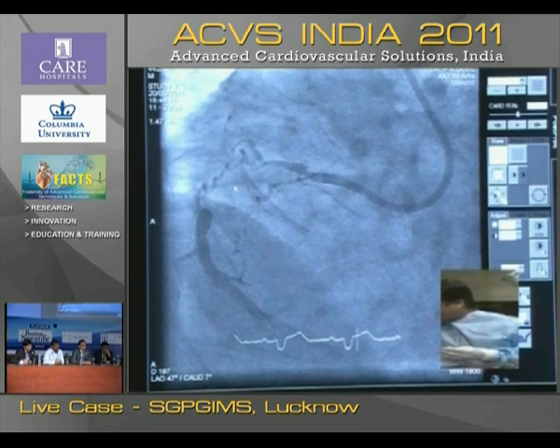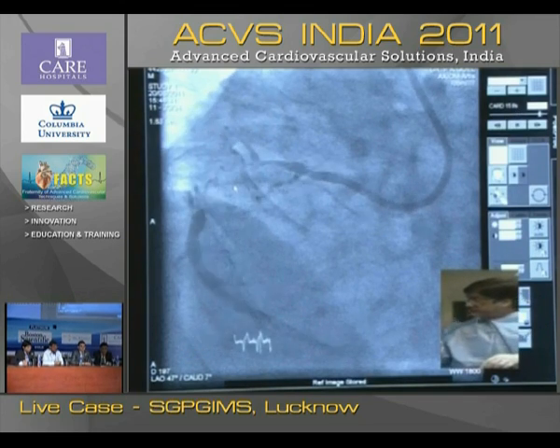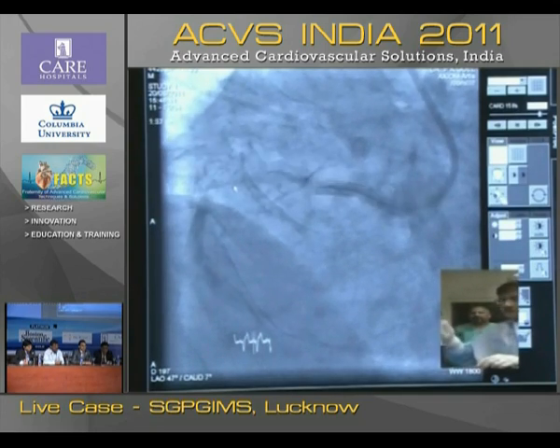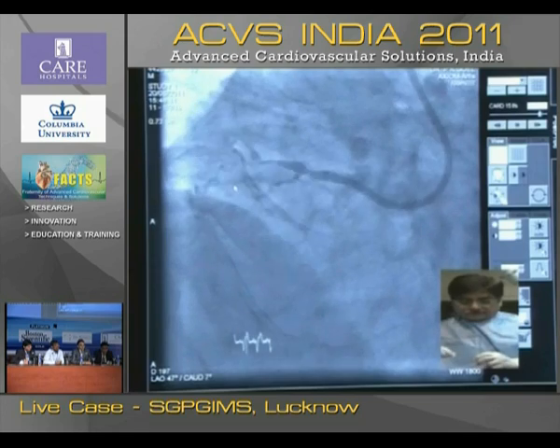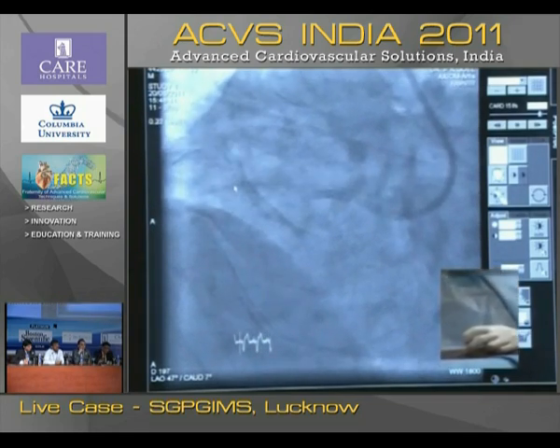Fielder XT. Put the Fielder XT in. So that's a micro catheter, which is the Finecross. Can you show the Finecross micro catheter? Focus here, please.